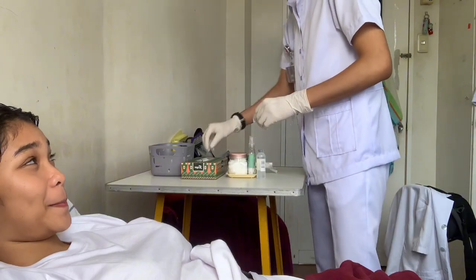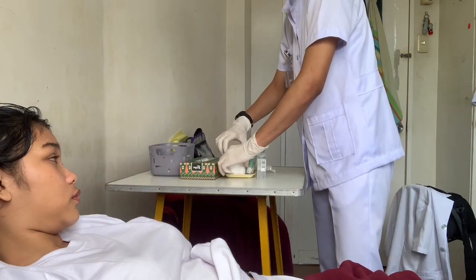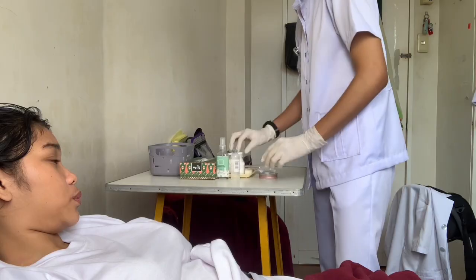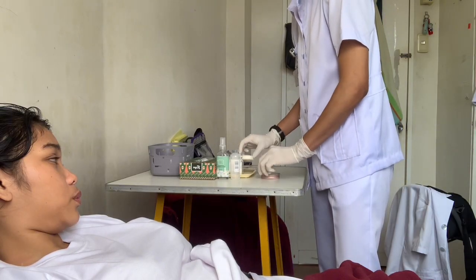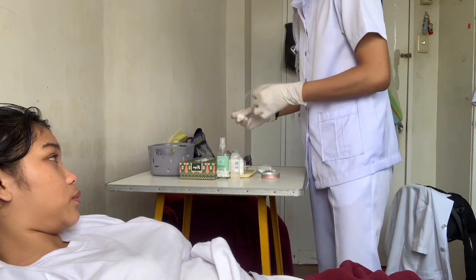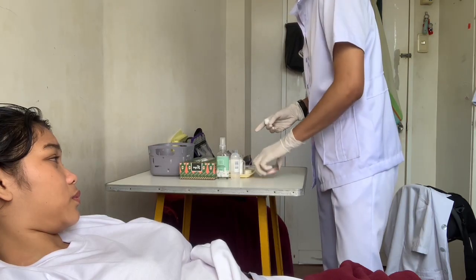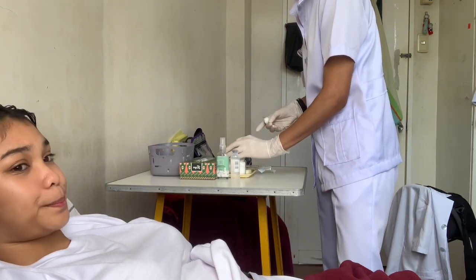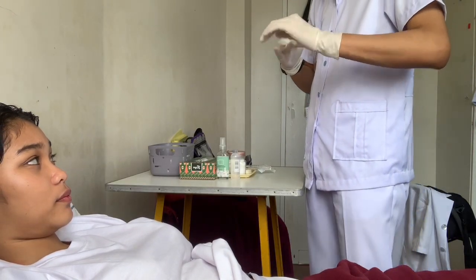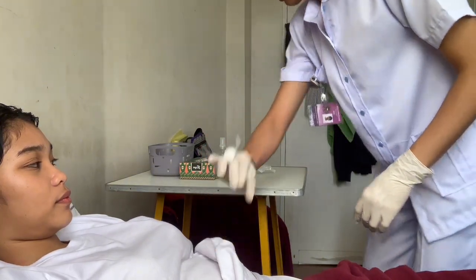Okay. So I have here... now pinch. Okay.